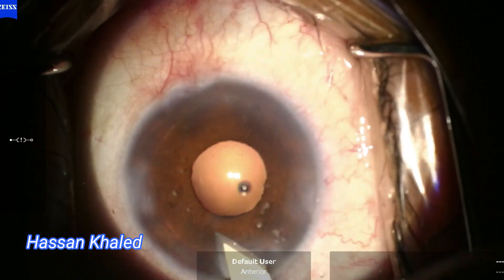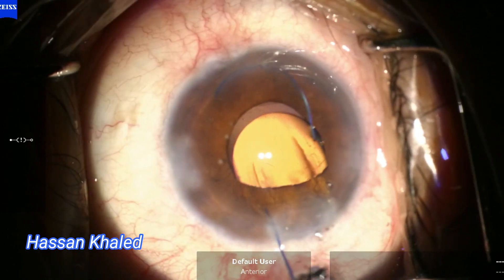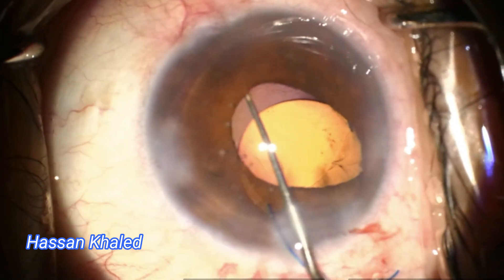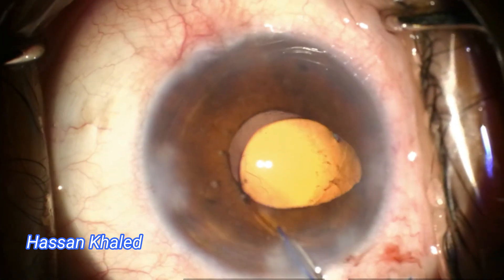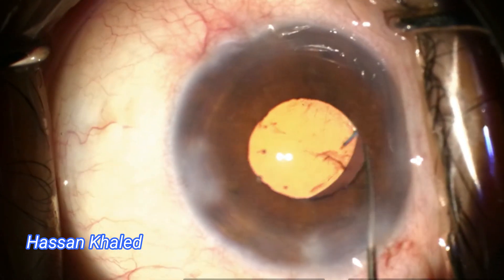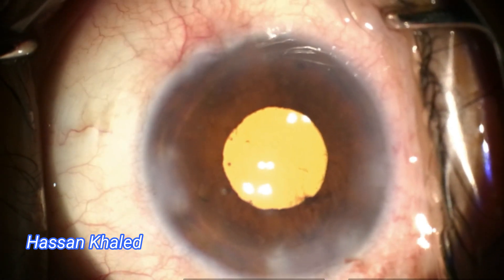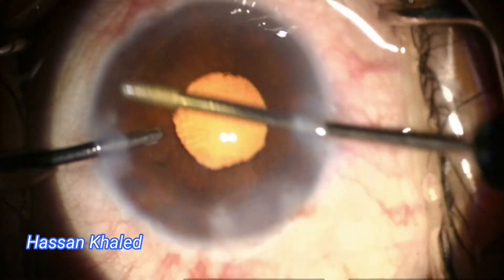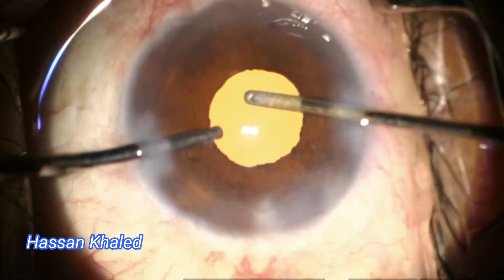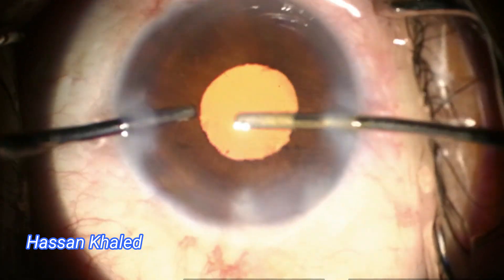So now, what should I do? Should I put a CTR in this case or just implant a 3-piece IOL? Implanting a capsular tension ring when there is a peripheral or equatorial posterior capsular tear is not suitable — it can cause more damage to the capsule. So I aborted that idea and placed the 3-piece IOL with haptics in the sulcus and capturing the optic within the capsulorhexis. Then removing the viscoelastic anterior and behind the IOL smoothly.